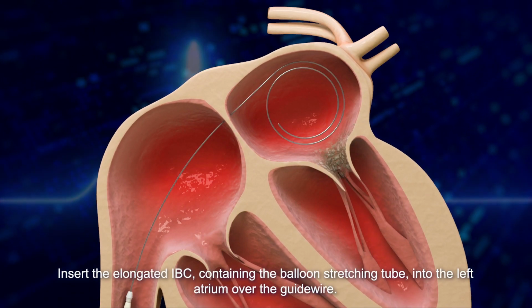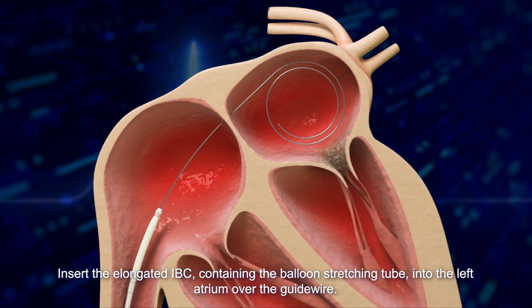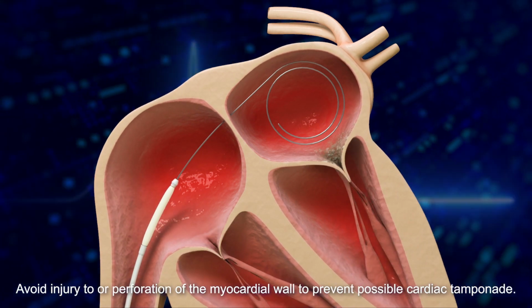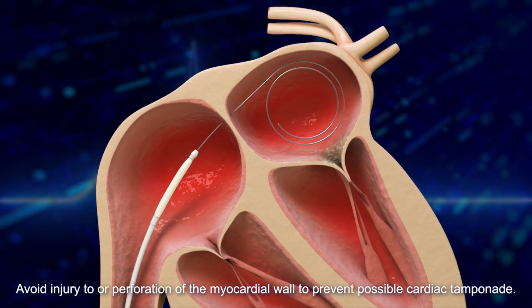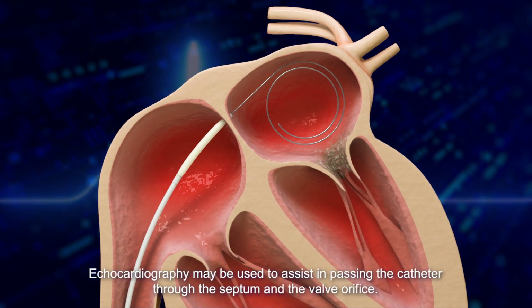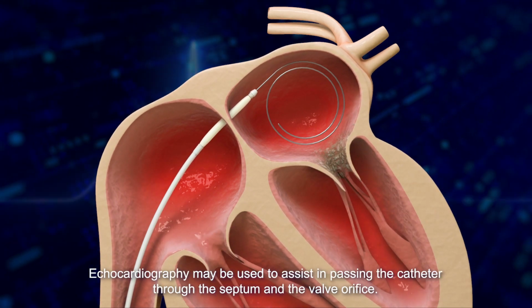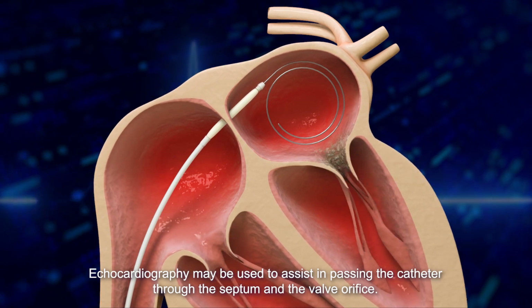Insert the elongated IBC containing the balloon stretching tube into the left atrium over the guidewire. Avoid injury to or perforation of the myocardial wall to prevent possible cardiac tamponade. Echocardiography may be used to assist in passing the catheter through the septum and the valve orifice.